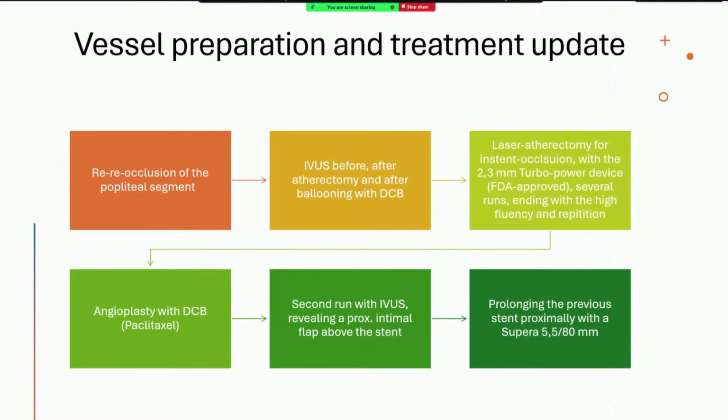After this, I always do an angioplasty with drug-coated technology, because as you know, you harm the intima, either with laser, or the Hawk, or the Phoenix. There is a repair mechanism, as we all know, which is ongoing for 6 to 10 weeks. If we don't prevent the healing and scarring inside the vessel, you will have an early reocclusion.